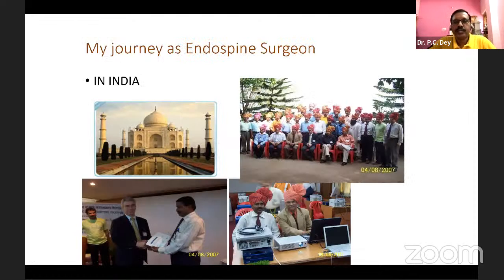So we have discussed the journey and the learning curve that Amit was telling, that you have to see the variety of the surgery. Maybe there are 4 endoscopic techniques at present we are practicing across the globe. That is UBE, Destandau, the full endoscopic, and the 4th one is the transforaminal. So you have to think about all 4, and then you decide, you prepare mentally that this technique I can take up, and you stick to one technique. As Amit was telling, it is very, very important. From the beginning, you have to decide that this technique I can do and go ahead.